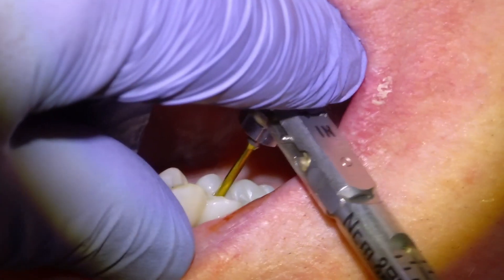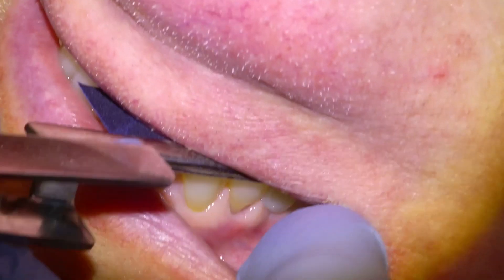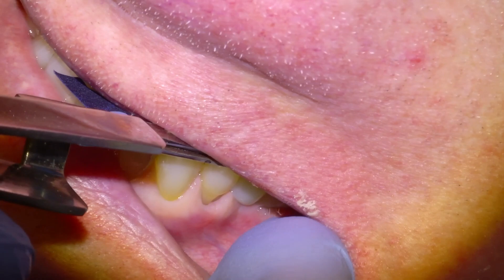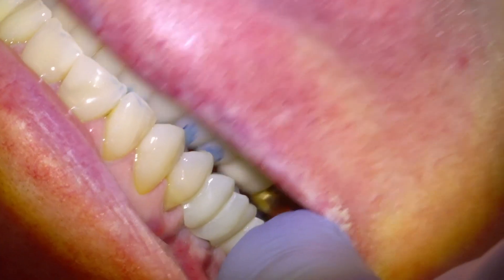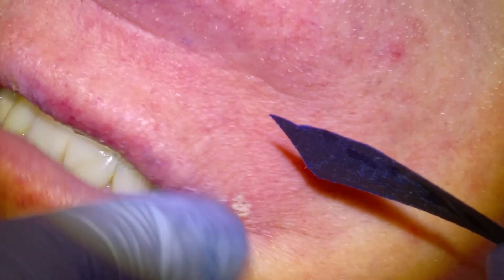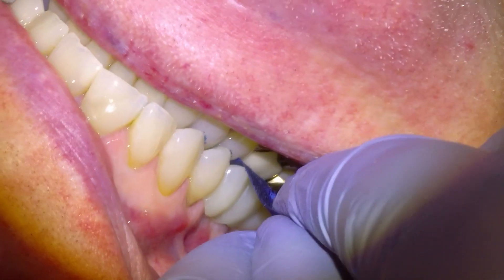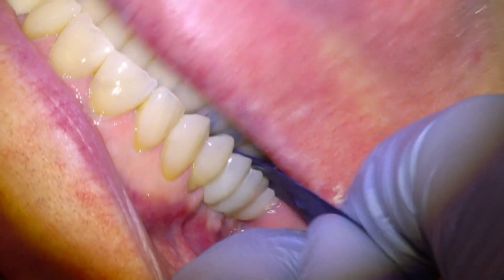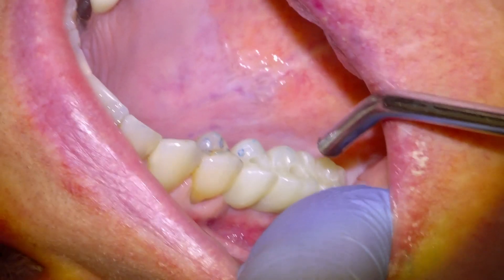Once the implant bridge has been torqued down, we're going to check the bite with this bite paper — articulating paper we call it — and that will mark any high spots on the implants. I'll usually leave implants just a hair out of the bite because they're so solid, essentially fused to the bone, and they don't have any give to them, so any contact really feels like an interference.